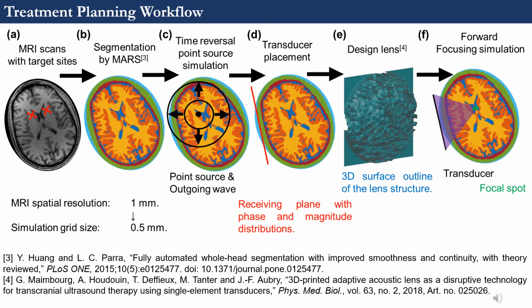The recorded magnitude is used to determine the optimal placement of the transducer inside the sensor plane for maximum power transmission through the skull. Finally, forward simulation is performed, revealing the resulting pressure distribution inside the head. Using this pressure distribution, thermal simulations can also be performed. Therefore, safety criteria can be ensured before stimulating human participants using the simulation results.